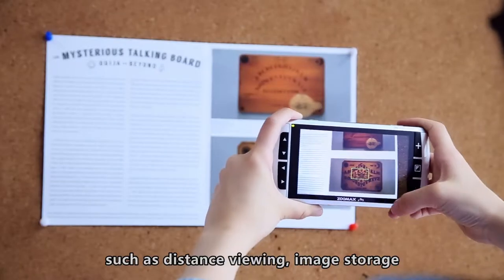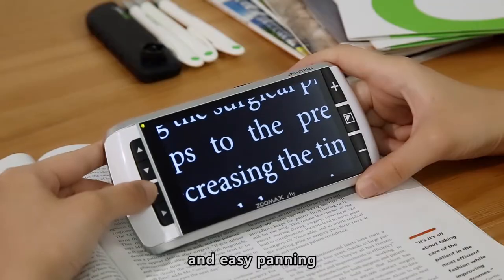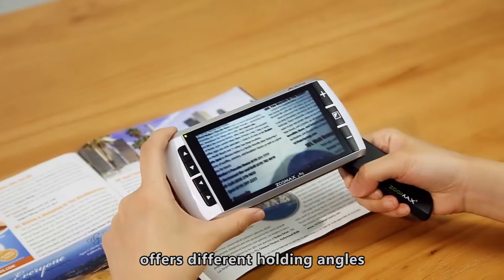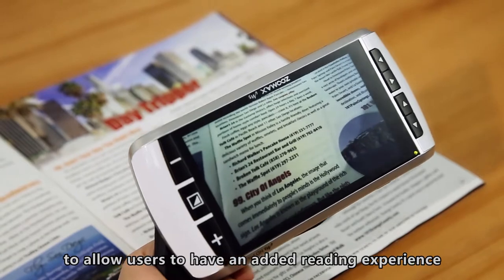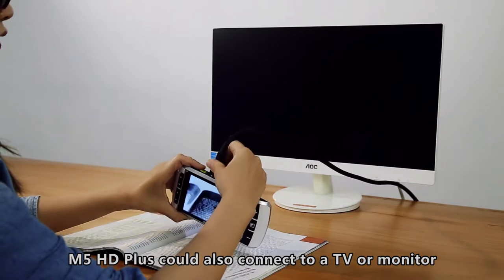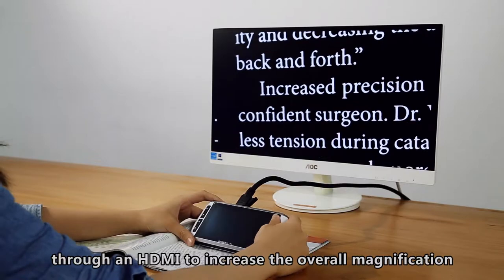Key features include distance viewing, image storage, adjustable reading line and masks, and easy panning. A complementary handle included in the package offers different holding angles to allow users to have an added reading experience. In addition, the M5HD+ can also connect to a TV or monitor through HDMI to increase the overall magnification.